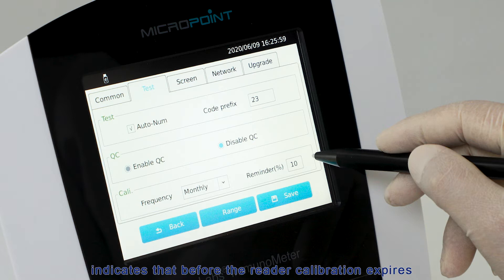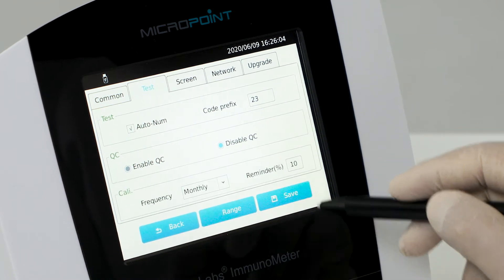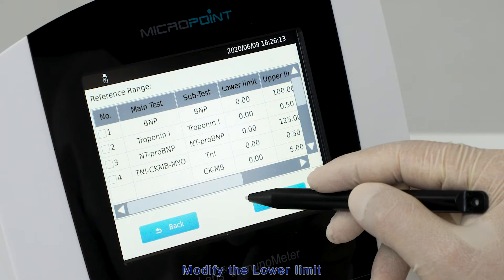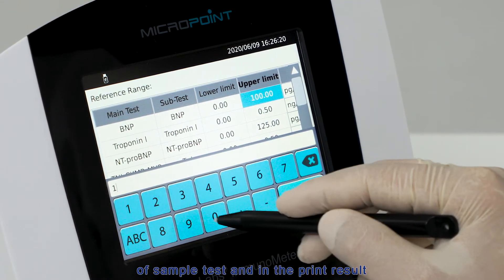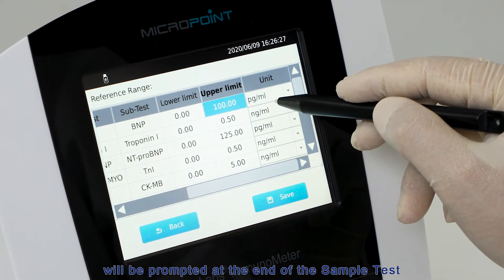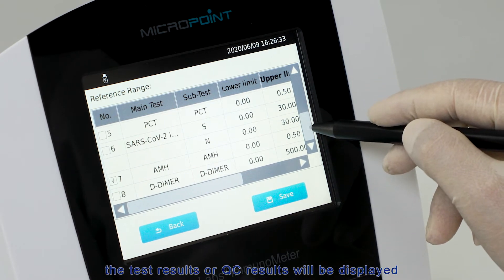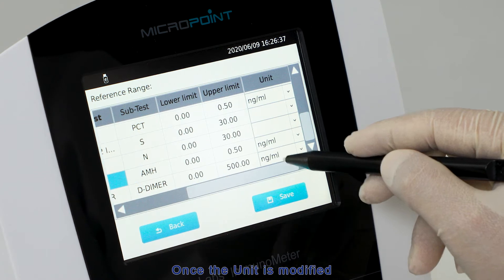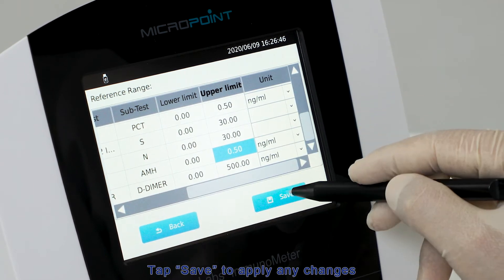The expiration reminder indicates that before the reader calibration expires, it reminds the user to run the calibration in advance — numbers 1 to 99% indicating the degree of advancement. Tap Range to access the reference ranges setting menu. Modify the lower limit, upper limit, and unit for each test item here. When the lower and upper limits of the reference range are saved, they will be displayed upon completion of the sample test and in the print result. If test results exceed the reference ranges, up or down arrow notifications will appear. The test results or QC results will be displayed and printed with the selected unit, such as nanograms per milliliter or picomoles per liter. Tap Save to apply any changes.